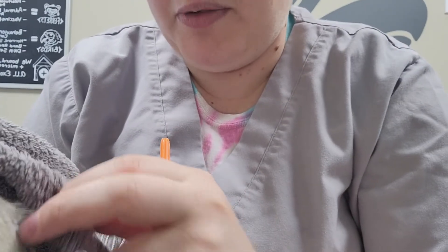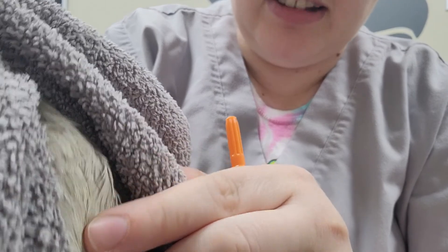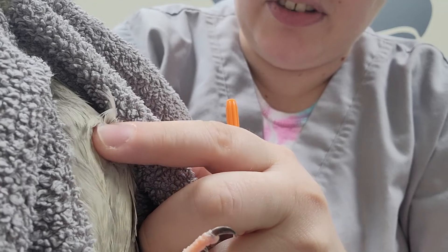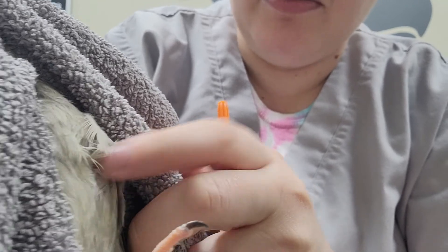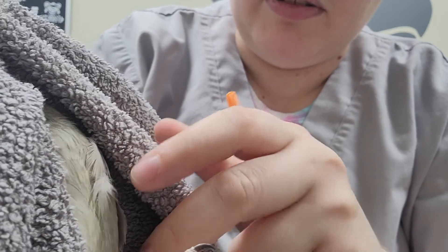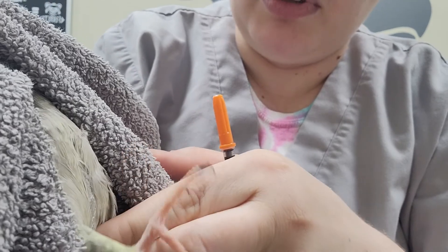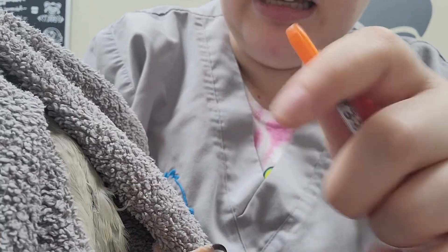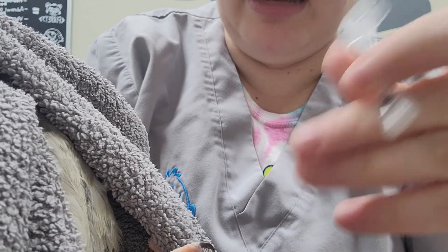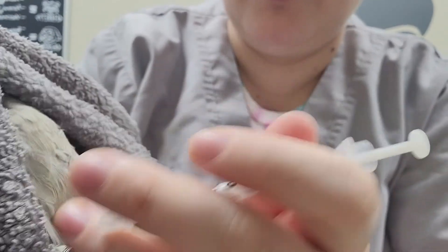Now that we know where we're going for our injection, we have Phoebe all caught up here. We're looking at her chest right here — this is her sternum bone here, it's kind of hard to see in the video, but I'm feeling it right now. We step off to one side or the other to give her injection. We want to make sure we're not going above her thoracic inlet or below the bottom of the keel, so going towards the meatier part is best. I have my injection ready — this is a fake injection, but we're still going to treat it like it's real.